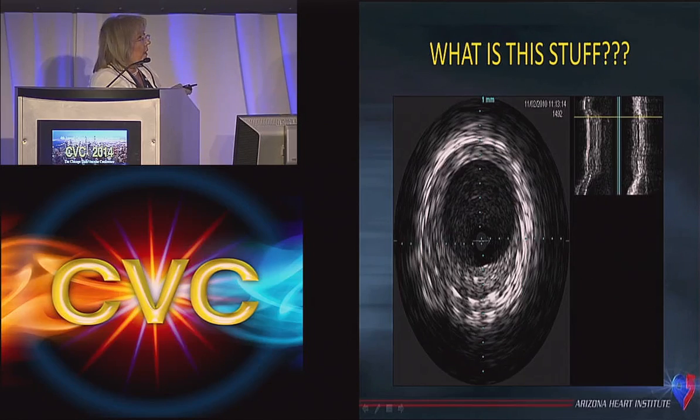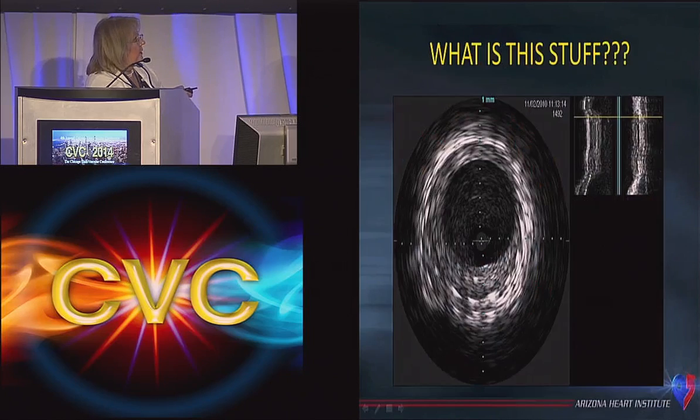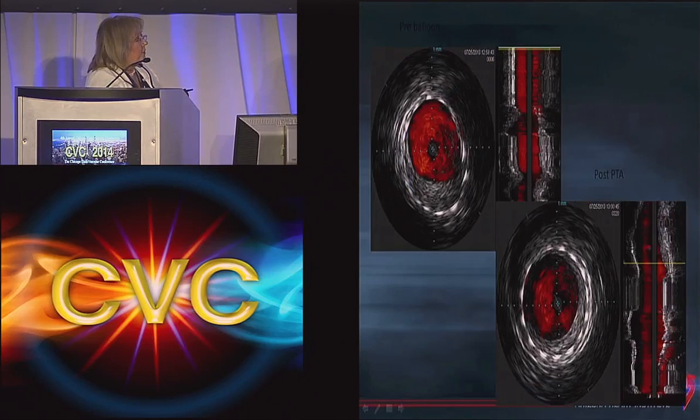So I ask you, a la Dr. Rook's kind of questions, what is this stuff? Now it's inside the vein, and you can't very easily get it out. You can see it there lining the circumference. Sometimes it's sort of eccentric, sometimes it's like this other one was completely surrounding, almost circumferential, leaving a lumen here, and it's actually quite a significant reduction of the lumen. With IVUS, you can measure the millimeter squared reduction. And it causes people to be symptomatic. And so what is this stuff?